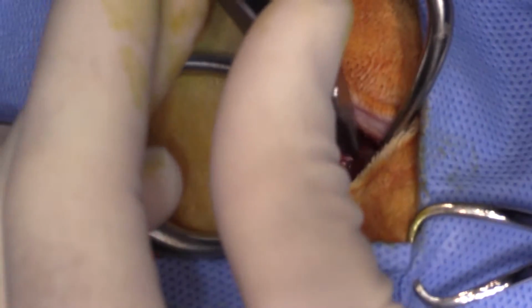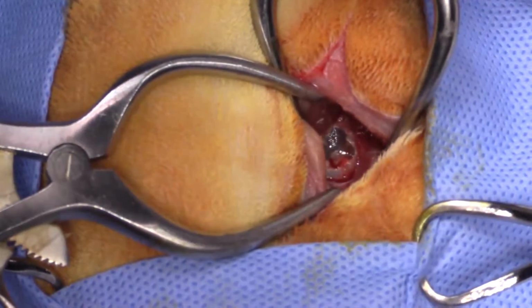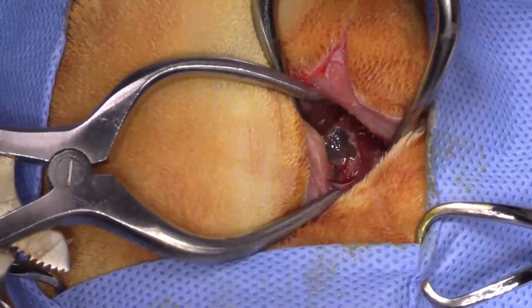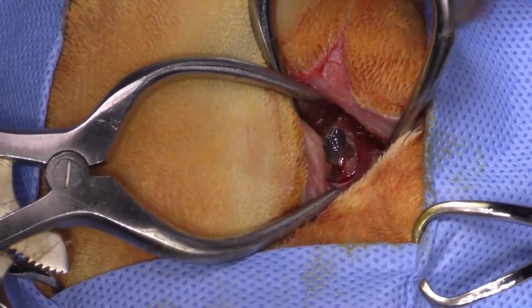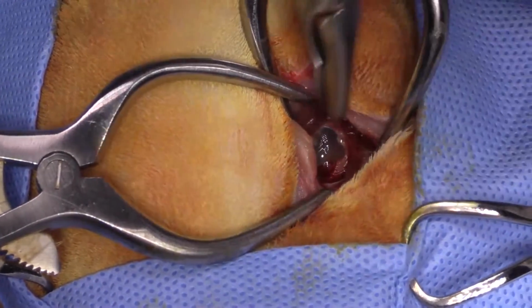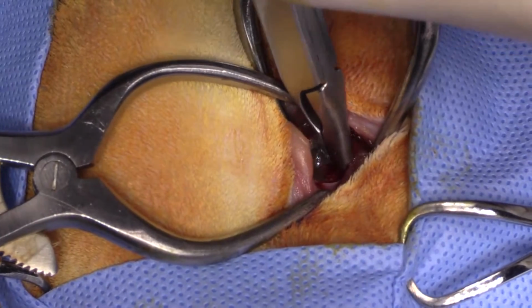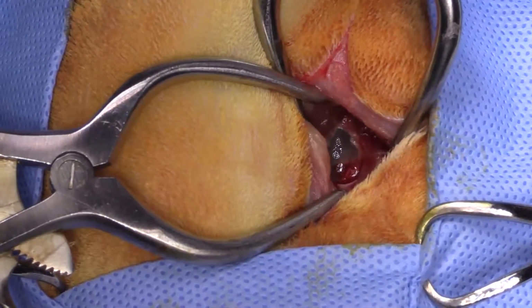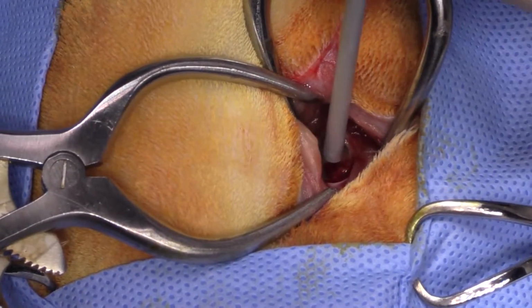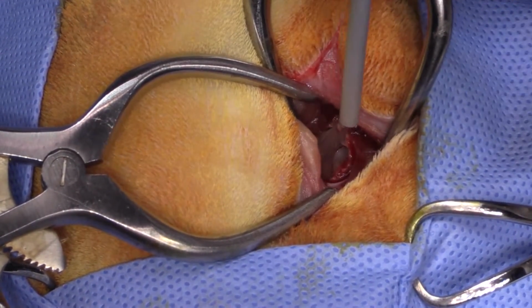This cat presented with middle ear signs, so it had really bad vestibular symptoms. I can see that mostly what's in that bulla is just mucoid material. We may get into more actual polyp as we go a little bit farther in, particularly in the dorsolateral chamber. So now I'm just going to suction out that mucoid material.